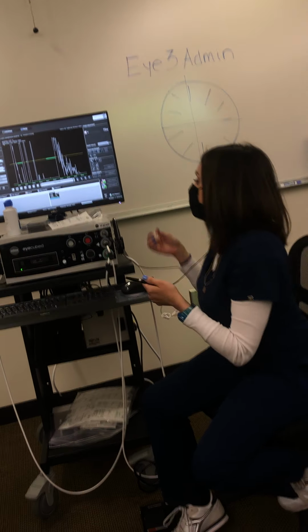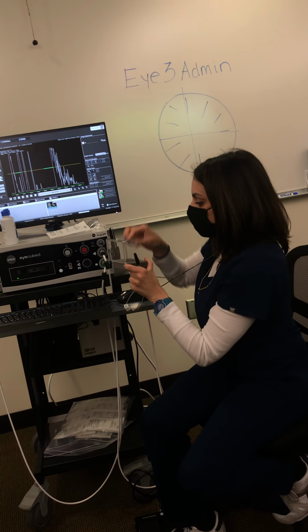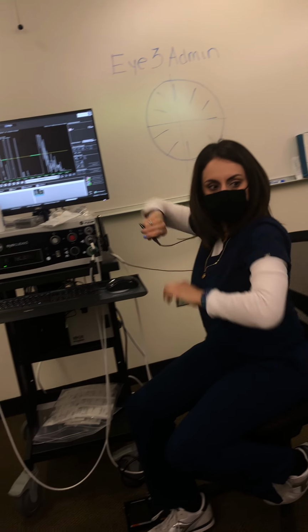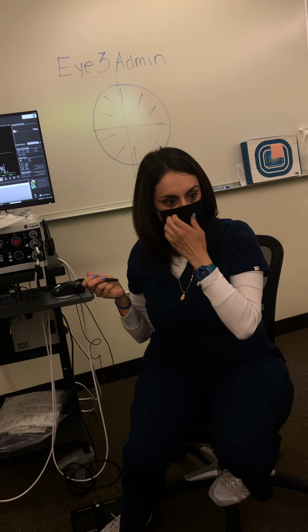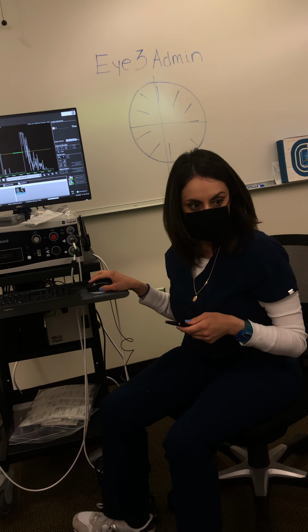Yeah, bleach. So just to show you kind of what the auto acquisition looks like, you sound like you had it pretty down pat. You sound like you're more comfortable with it. That's good. I don't do it on patients, but I can actually do it on people.